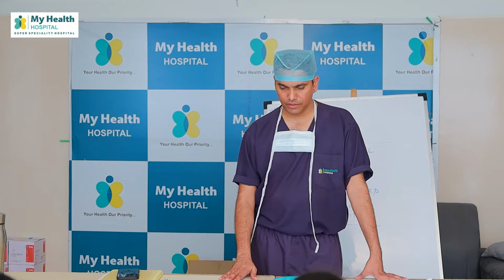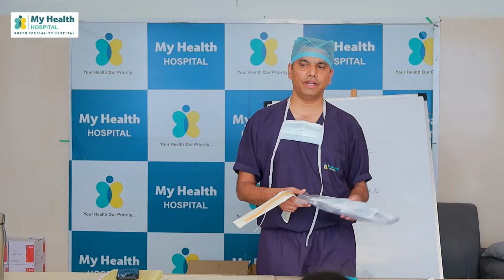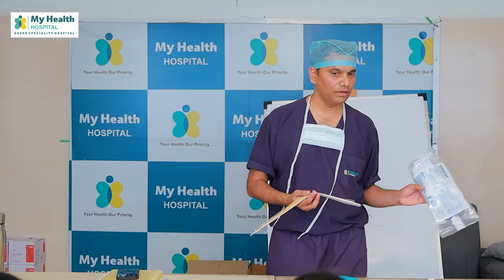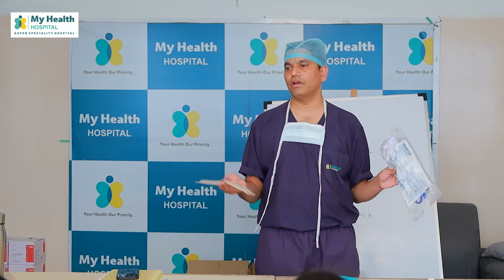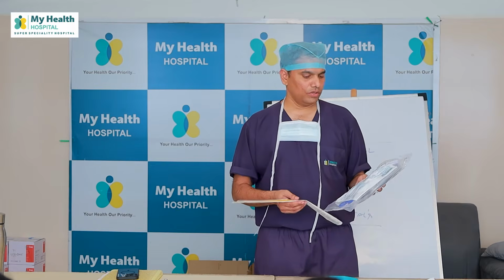Where do you connect it to? Do you always have to connect to a urometer? What is the indication of urometer? To calculate hourly urine output in surgical patients, ICU patients who are really sick, where output really matters. CKD patients. Wherever urine has to be monitored, input output has to be monitored, we need a urometer.